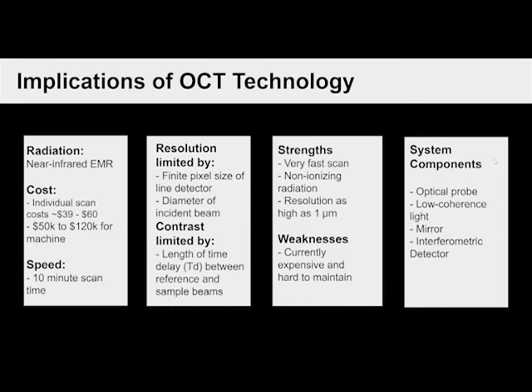Finally, some system components of OCT include the optical probe, the low coherence light, the mirror, and the interferometric detector.